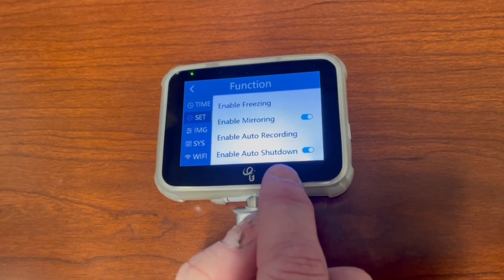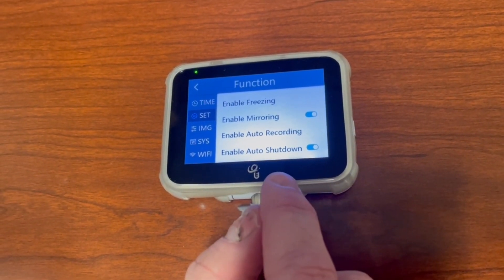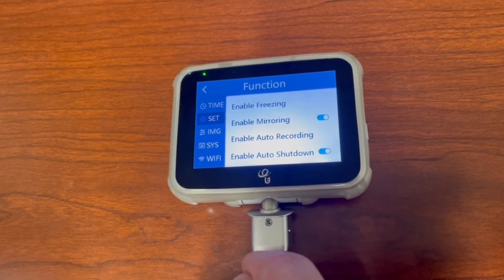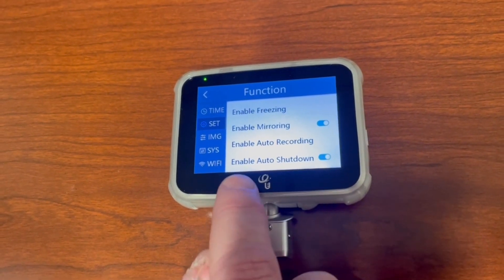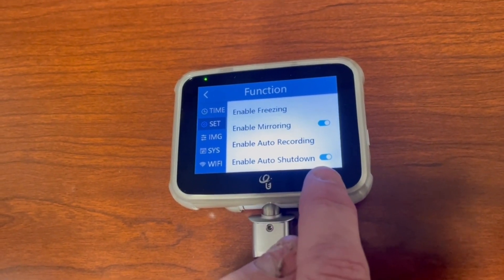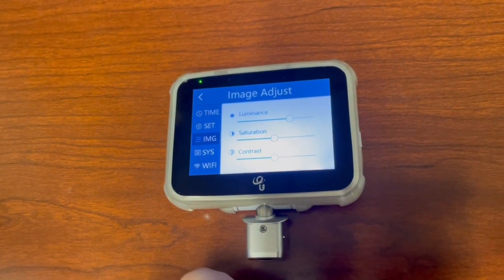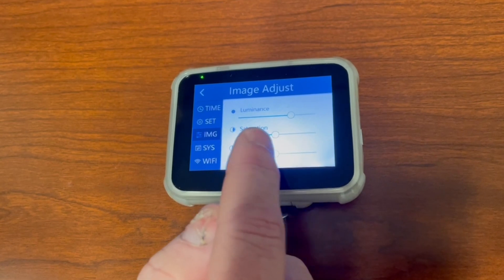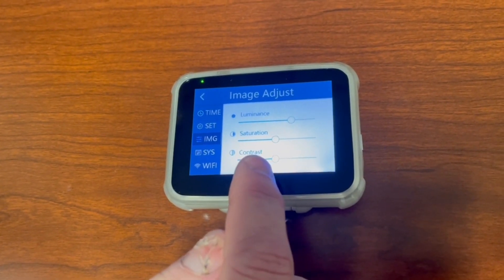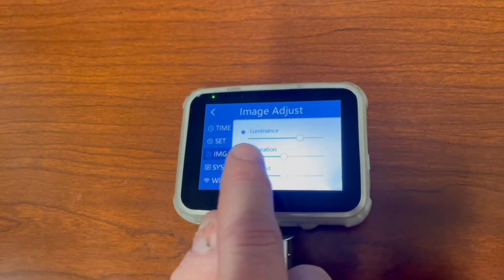Keep enable auto shutdown on — if you forget to turn it off, in 10 minutes it will turn itself off. So on the settings screen: enable mirroring should be on, and enable auto shutdown should be on. Under IMG — the image adjust — this is where you can make the screen lighter or darker, adjust saturation and contrast, useful if you're intubating in direct sunlight. This is your screen brightness screen — that's what luminance means.